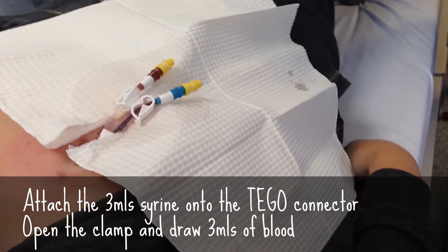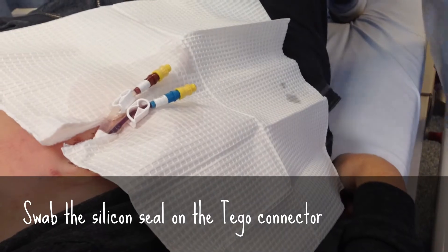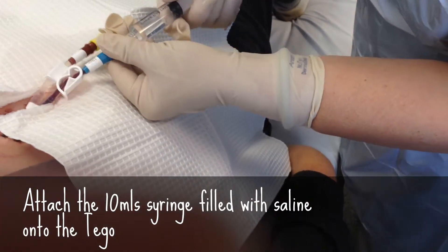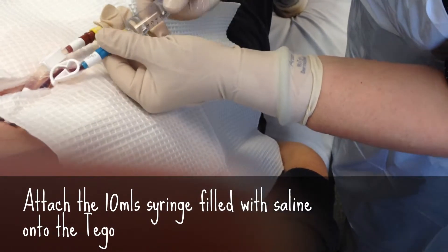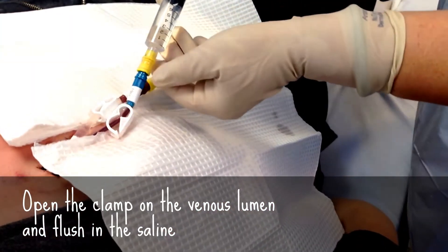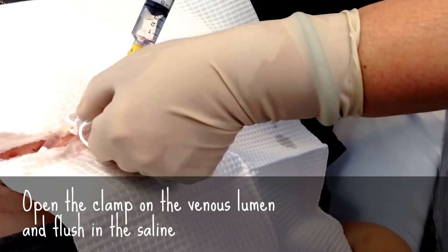Not too wet, just squeeze off. Swap that. Line again. Hold the toggle. Push that in. Release the clamp. Draw a little bit. It's coming out nicely. Flush that.